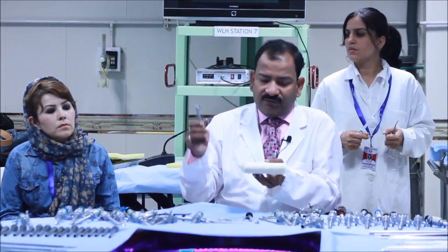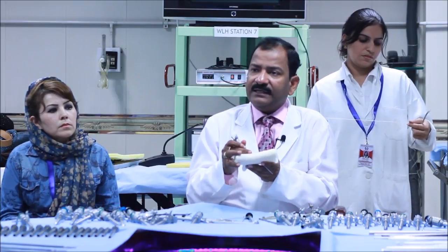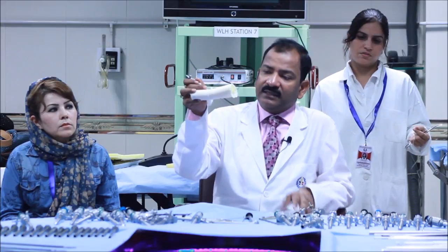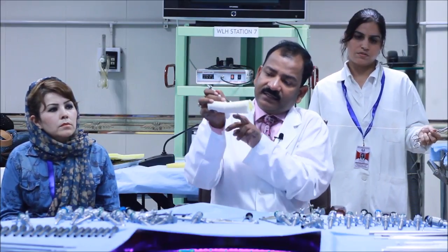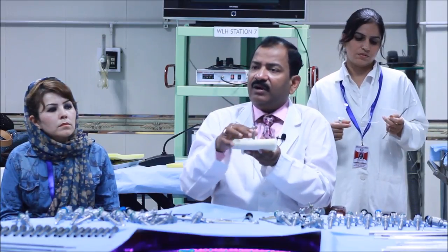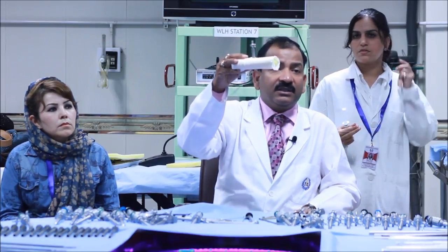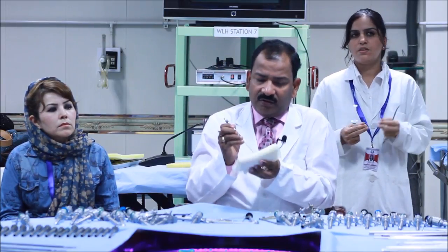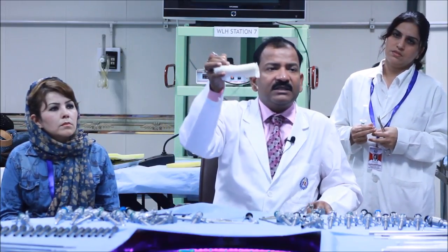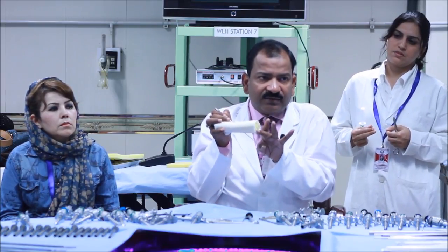Third advantage is, if you are going towards the anus, your vertical entry is 50% and your horizontal entry is 50%. Like this is called vertical entry and this is called horizontal entry. If you go perpendicular, your vertical entry is 100%. Horizontal entry is 0, but if you go at a 45 degree angle, then your horizontal shift is 50% and vertical shift is 50%.